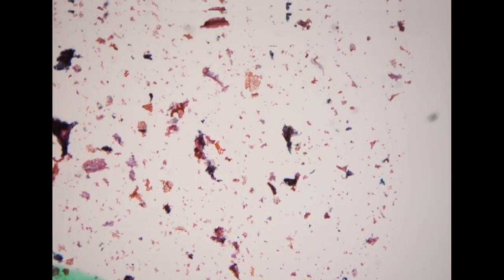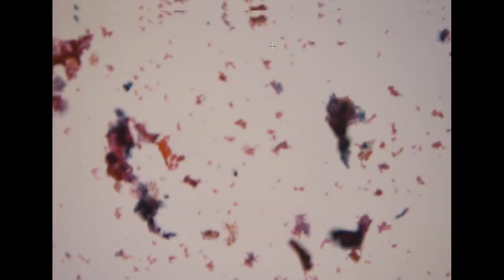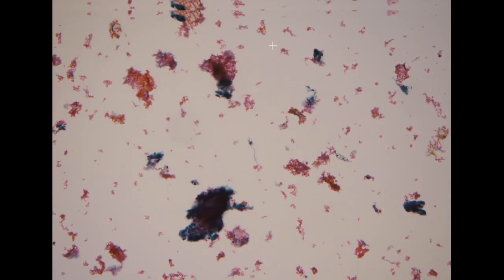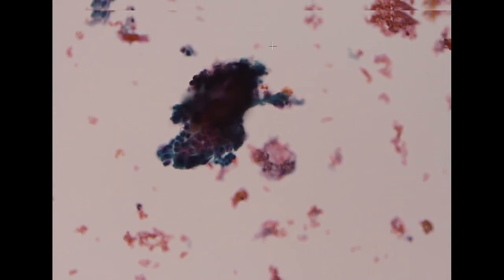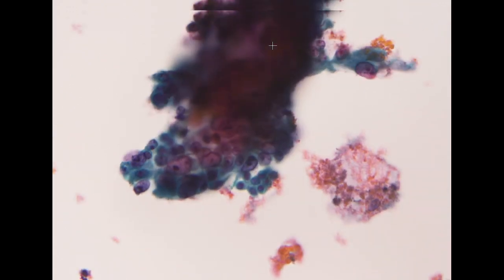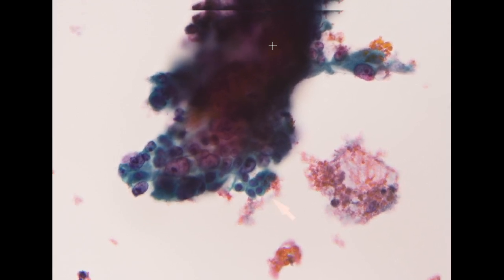In this brushing cytology, you can appreciate in the background we have a lot of blood clot. So it is likely that the brushing was after the biopsy, so that's why we see a lot of blood. But we also have similar morphology of the same tumor cells that we see in the direct imprint smear. So this is also positive for adenocarcinoma.